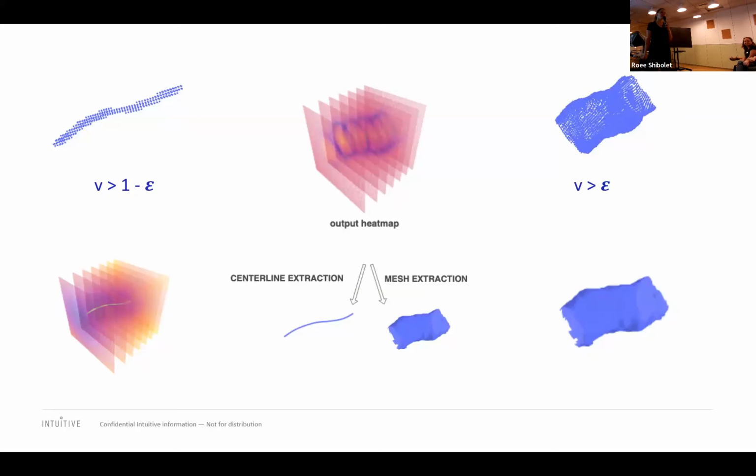So your original data comes from, like, grayscale maps? Sorry, I didn't understand. From grayscale? No. From a CT scan. The training data comes from CT scans from which we extracted the mesh. Okay.